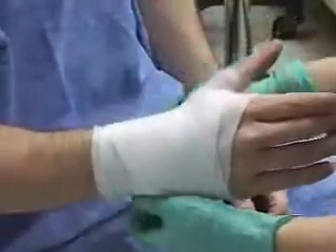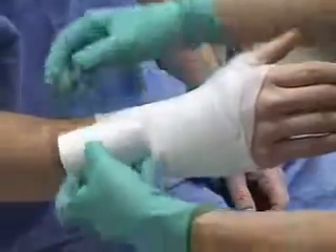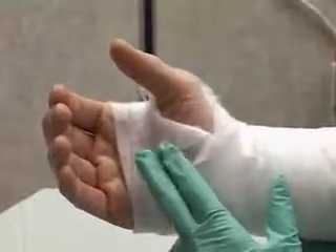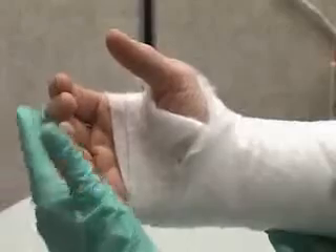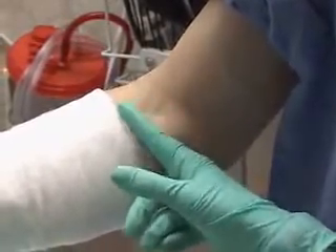Continue to wrap the forearm, placing the web roll — not pulling — and overlapping the material by about half its width. The covered area will extend from the distal palmar crease, leaving the thumb and fingers free, to the antecubital fossa, allowing flexion of the elbow.